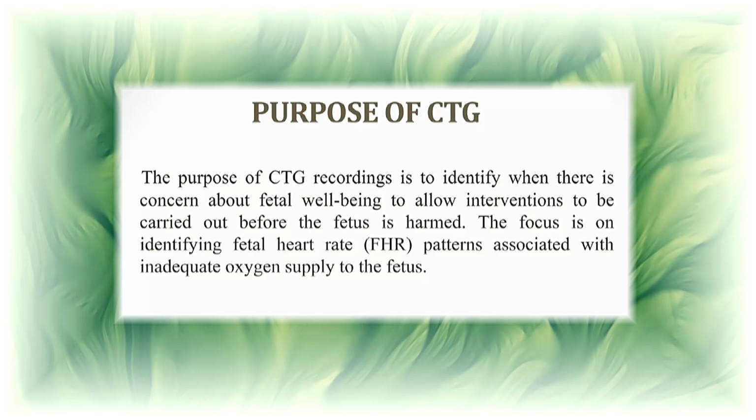Here we'll discuss the purpose of CTG. The purpose of CTG recording is to identify when there is concern about fetal well-being, to allow intervention to be carried out before the fetus is harmed. The focus is on identifying fetal heart rate patterns associated with inadequate oxygen supply to the fetus.